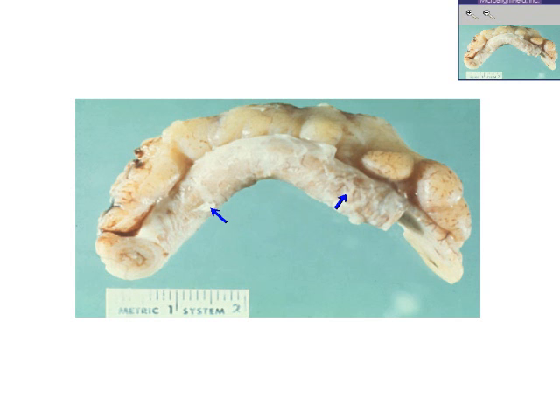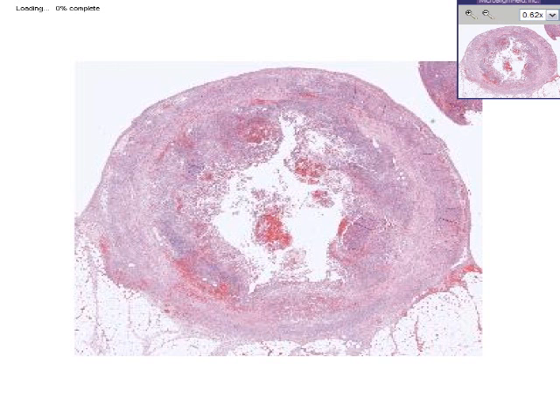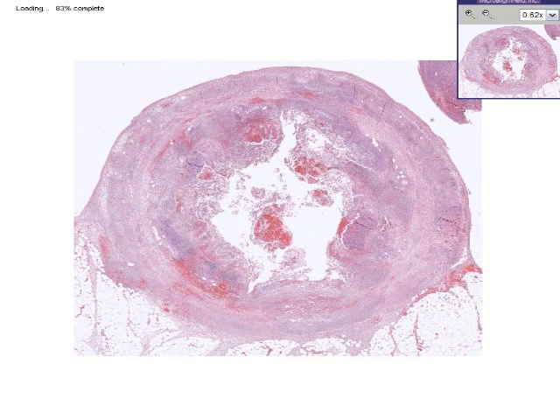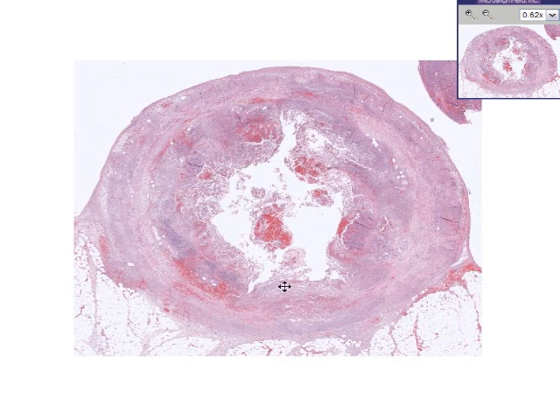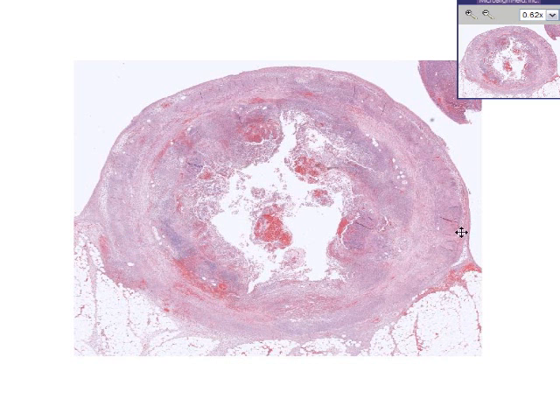Let's go to the microscopic view of this. You see a lumen, lymphoid tissue within the mucosa and probably submucosa, the wall, and the fat down here as well.